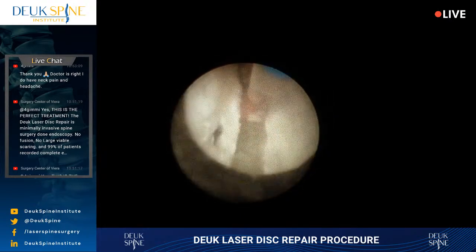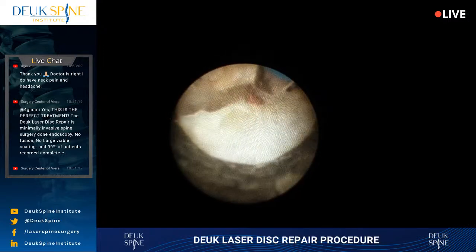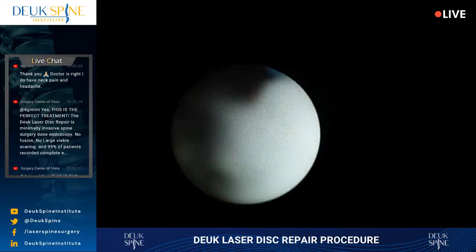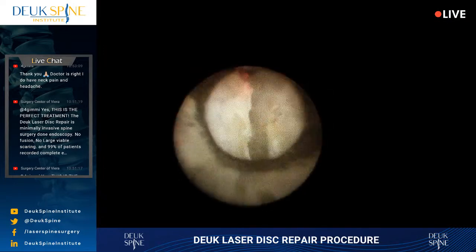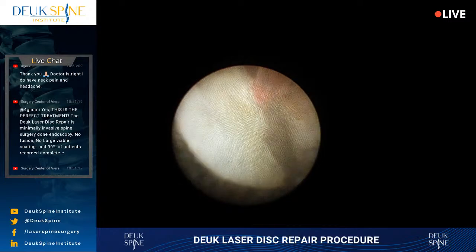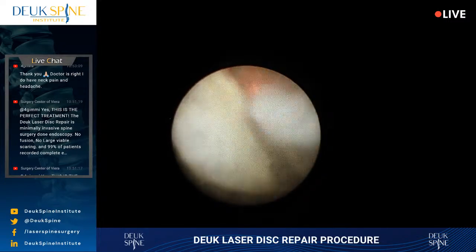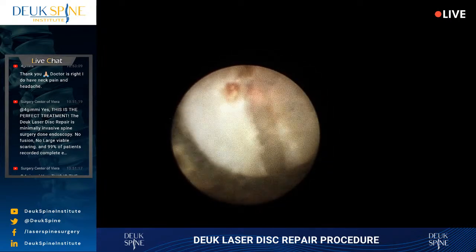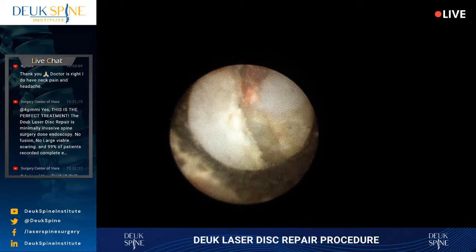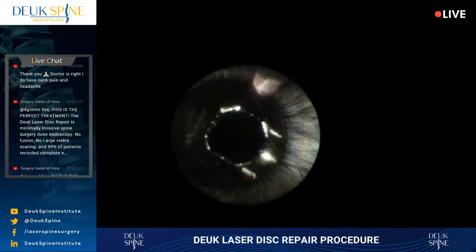We have a couple more questions. I'm going to sweep over to the other side just to look, because remember, this patient doesn't just have left arm symptoms. He also has headaches and neck pain. So I got to make sure I fix the headaches and neck pain as well. To do that, I got to get the whole disc, not just one side. I got to get all the herniation and annular tear in the back. We're just about done with this disc, then we're going to move on.